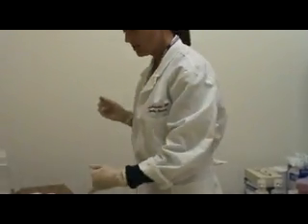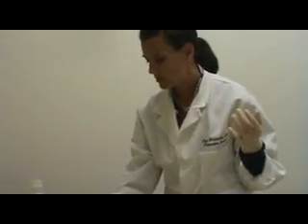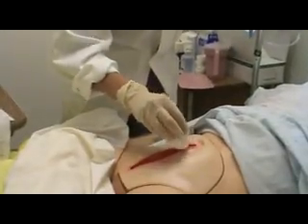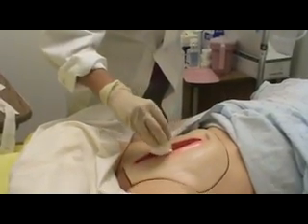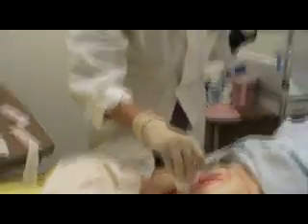Then I am going to take — now this is no longer sterile so it is okay if I reach over — I'm going to pick up my dry 4x4 and then pat the wound bed to remove any excess saline that may have gotten in the wound bed with the cleaning.